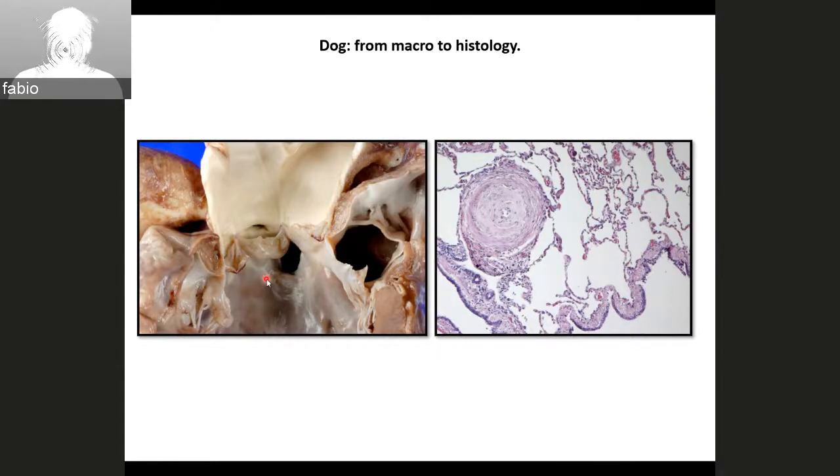Actually, I can see the septal leaflet of the mitral valve on the left part of the picture. And then on the right side, I can see the cusp of the aortic valve and the coronary sinus. I think just below, ventral to the non-coronary cusp, I can see there is a communication.